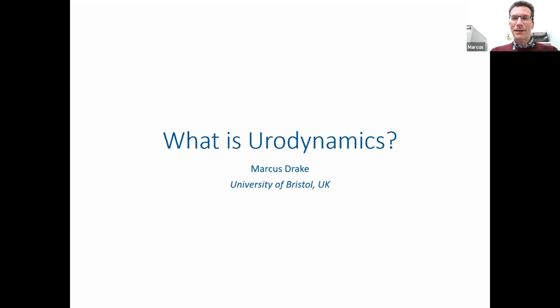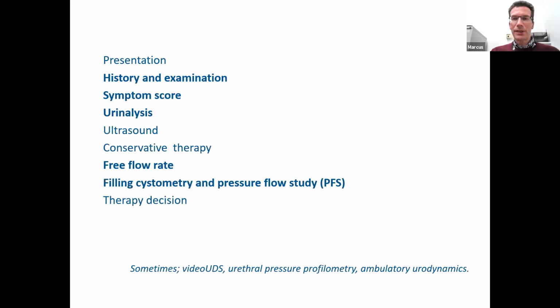Well, good evening, and thank you very much, everybody, for giving up your evening. This is a very important aspect of our clinical practice in the International Continence Society. So I'm just going to do about 10 minutes on the very basic aspects of urodynamics. This is a test that actually forms part of an overall assessment pathway. Of course, somebody presents to their doctor, and the history and examination is always the starting point of any clinical evaluation, including for lower urinary tract symptoms.